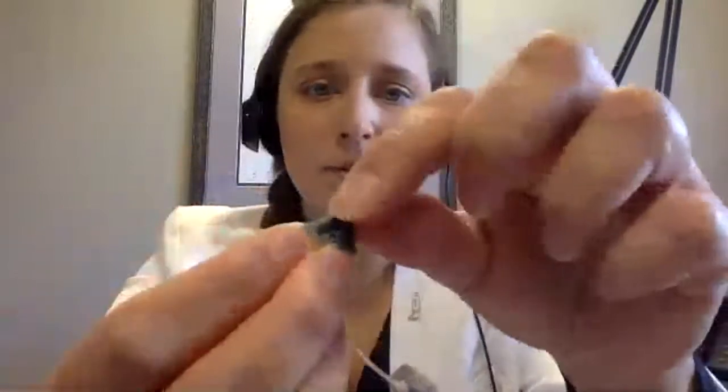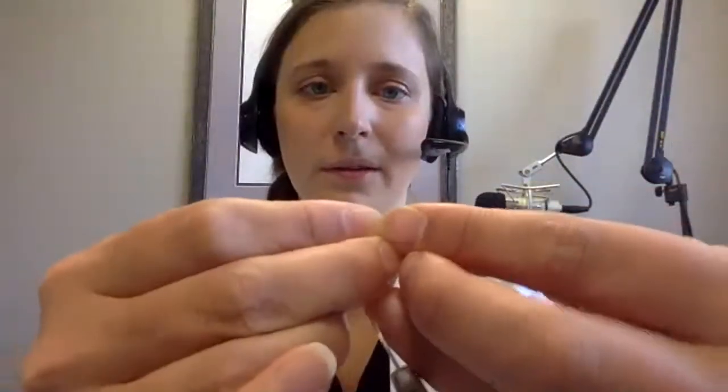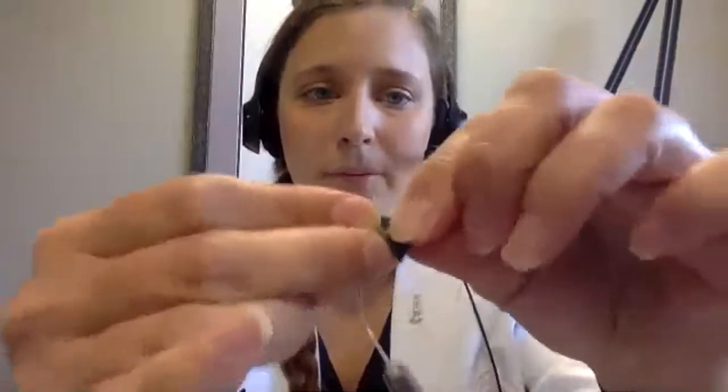So on your dome, on the inside, there's a little cup. We need to get that cup along the stem. I like to come at it at like a 90-degree angle like this. You're going to pop it on over the top. I don't know if you could see that. So when I give that a pull, it's on there nice and tight. If you get it on there kind of loose, it's just going to pop right off. So make sure once you get that all the way on, give it a little pull, make sure you got it on there nice and secure. All right. Most of the time, that's going to do it for you.